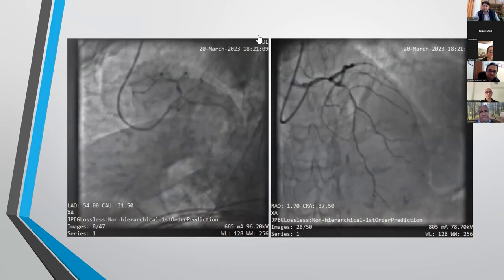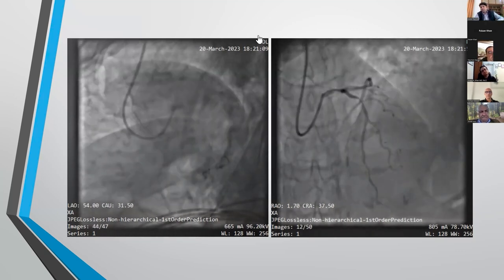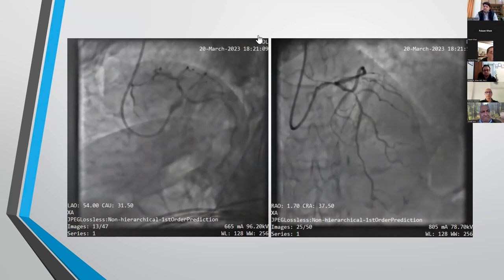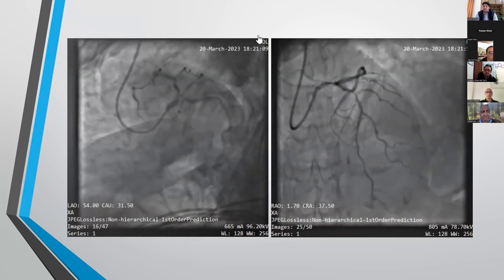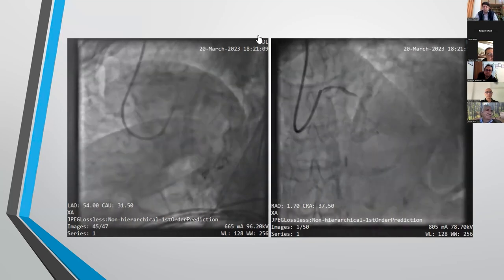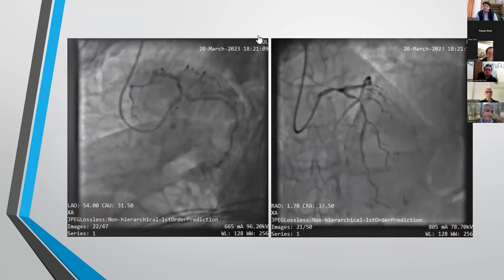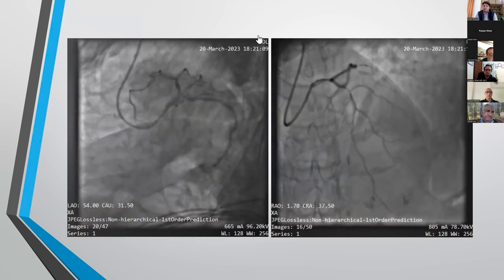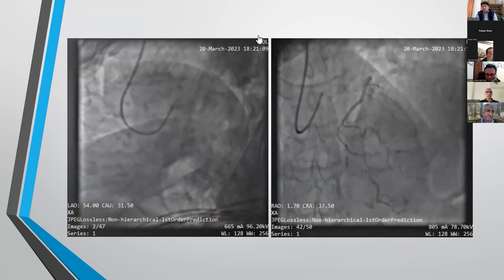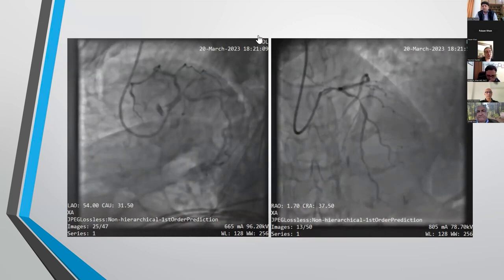And then after stenting, we'll post dilate the proximal portion of the stent more towards the proximal vessel diameter, and try to get 90% of the distal reference, have it well apposed, and try to get a minimum of 5 millimeter square. Sometimes you will not get that 5 millimeter square, even if you're getting 90% of the distal reference area and it's well apposed, and that's okay because some people will not have that vessel size. But in most people 5 millimeter square can easily be achieved, and we should try to achieve that. So those were the criteria and thoughts on stent deployment.